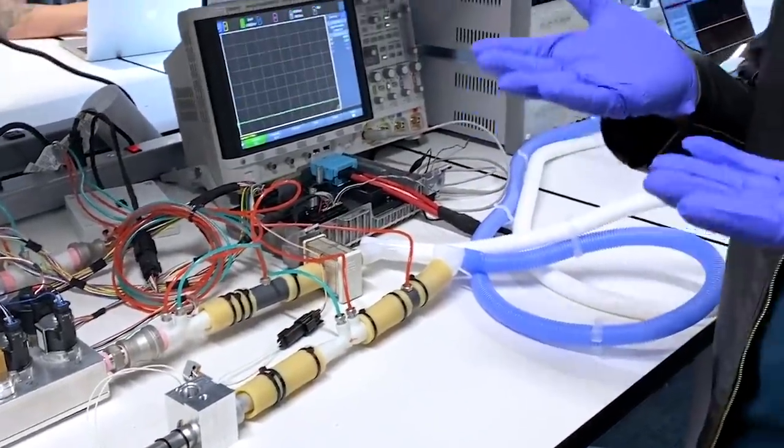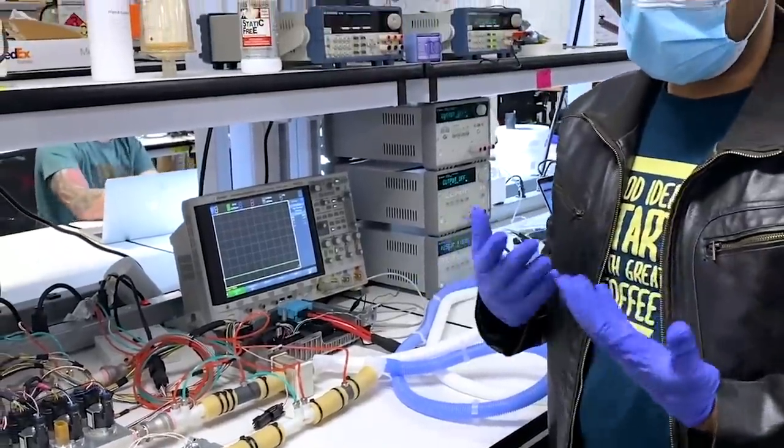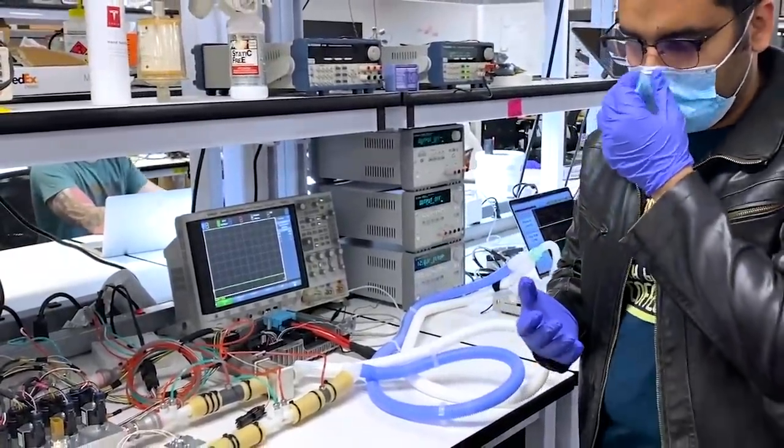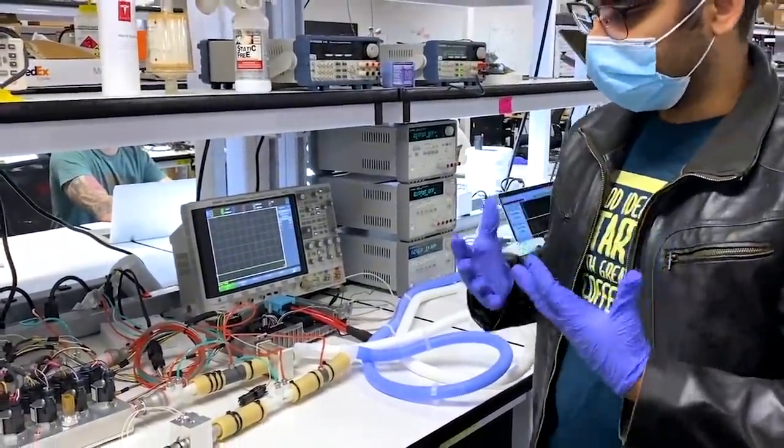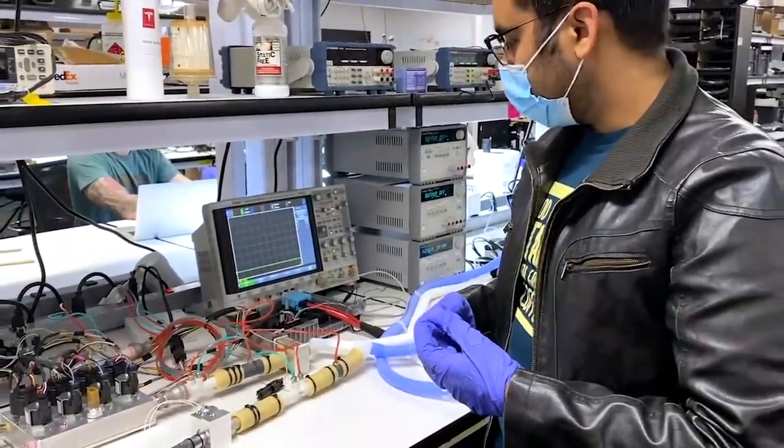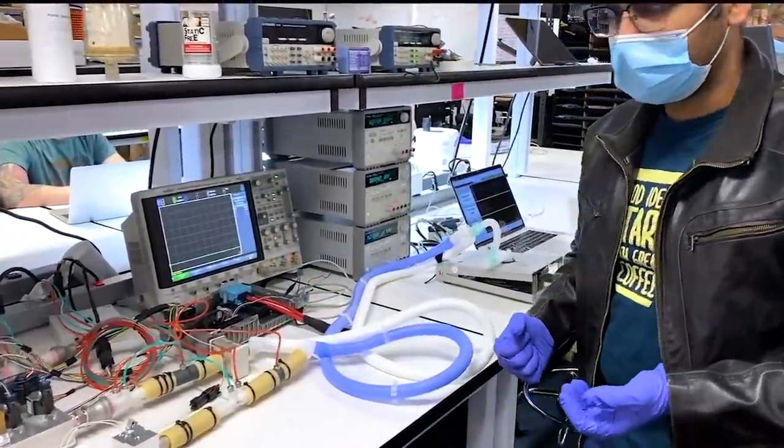So you always keep a positive pressure on the lungs, which helps the COVID-19 patients to breathe, keeps their lungs open. So yeah, that's the Tesla ventilator first prototype.